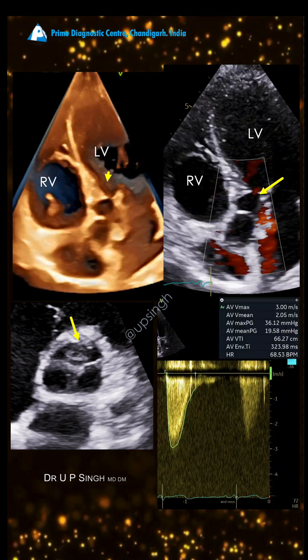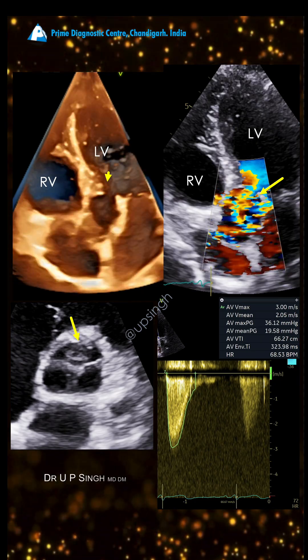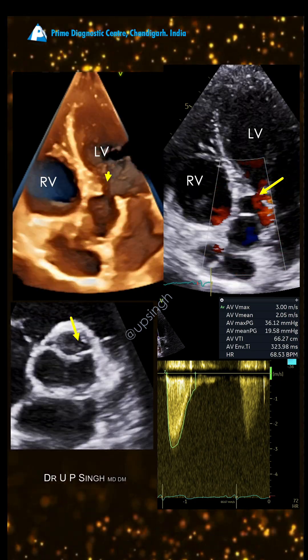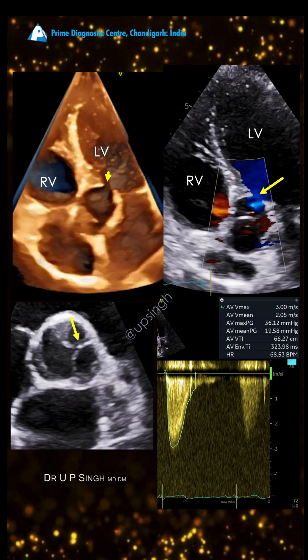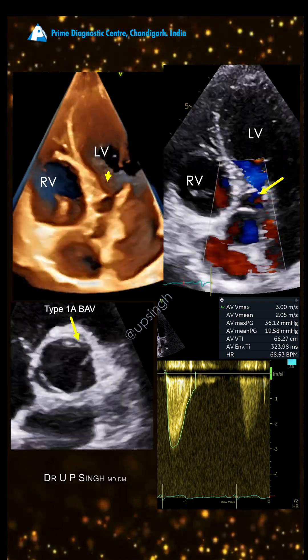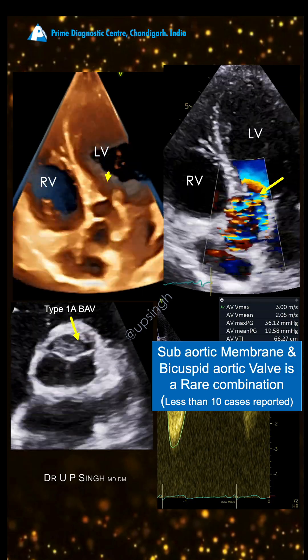The gradients were not too high, so this patient does not need any surgery right now. But the twist was that there is a bicuspid aortic valve associated with this — this is a type one bicuspid aortic valve. The combination of sub-aortic membrane and bicuspid aortic valve is rare.